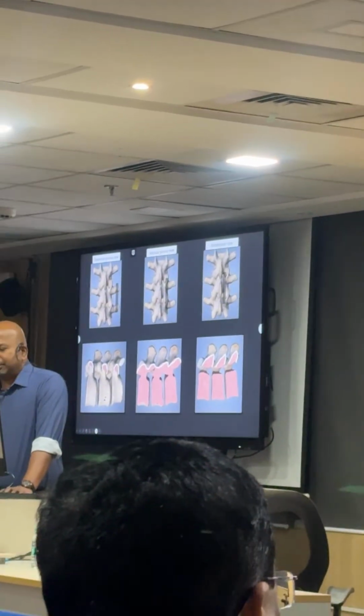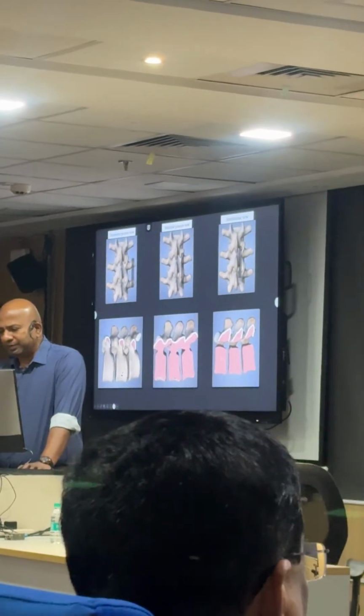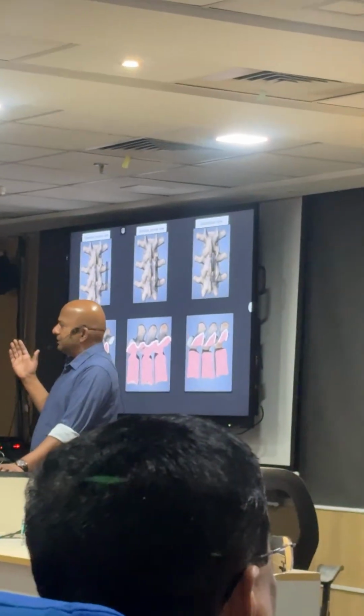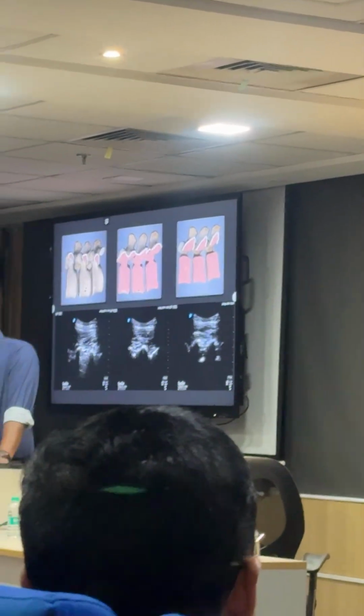So you can see the lamina is never flat. There is a ramp going up and then coming down. Between the two ramps, you can see the interlaminar window through which you are going to look at the spinal cord. So this is how the paramedian sagittal oblique view is going to cut the central neuraxis in this plane. So how does the ultrasound image look?